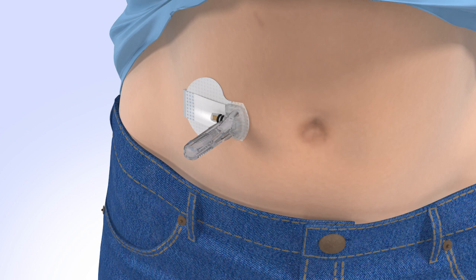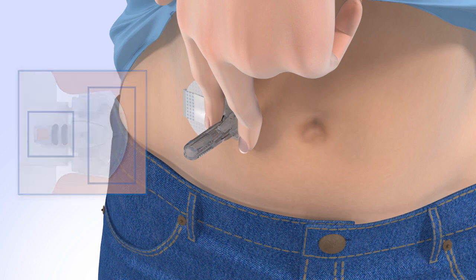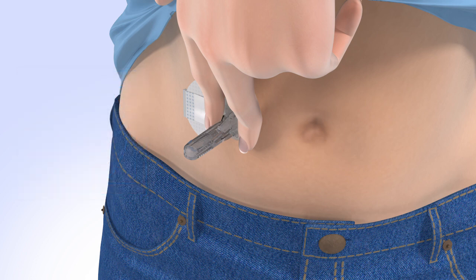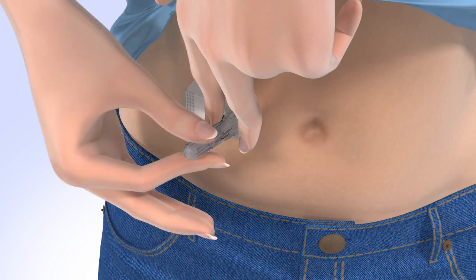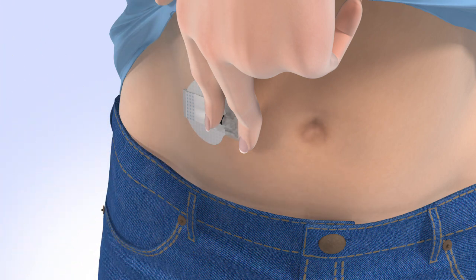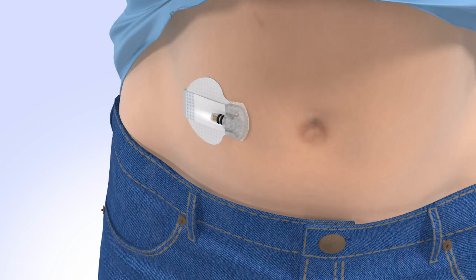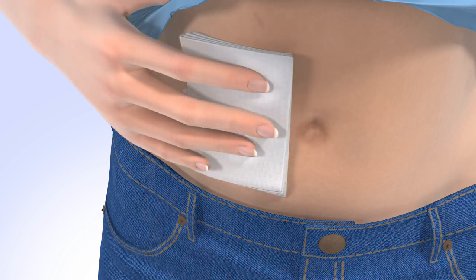Now you'll need to remove the insertion needle. If someone else is performing this step for you, please refer to the user guide for instructions. With one hand, gently hold the sensor by placing one finger on the front of the sensor and one finger on the sensor connector to ensure your glucose sensor stays in place. Be sure you do not hold or pinch the sides of the sensor. With the other hand, hold the needle housing at the tip and slowly pull straight out, away from the sensor. The needle automatically retracts inside the plastic needle housing. Discard the entire piece into a sharps container. If bleeding occurs at your insertion site, apply steady pressure using sterile gauze or a clean cloth for up to three minutes. Please consult the user guide for what to do if bleeding does not stop.